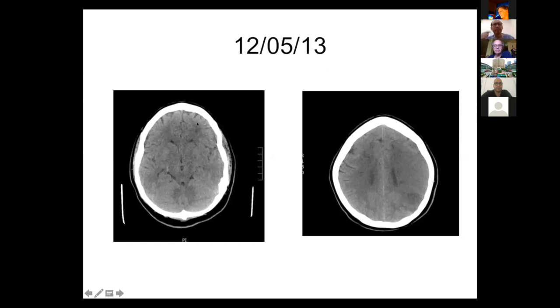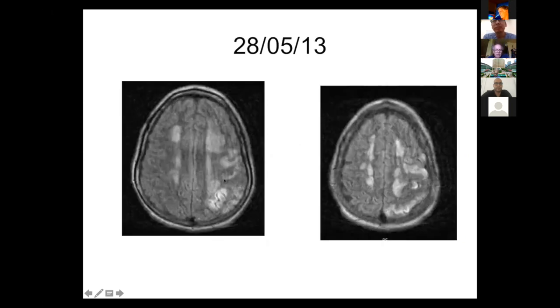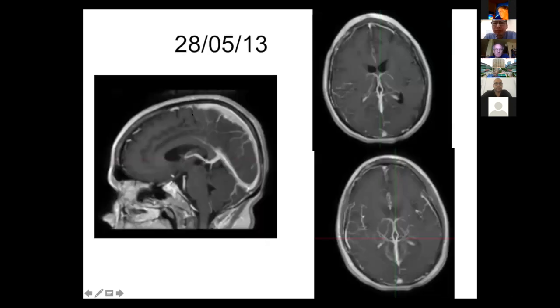The control CT scanner one day later showed all the ischemia and edema in both cerebral hemispheres. On MRI, there were some diffuse changes in the oval center and the old ischemic areas. At reconstruction one week later on MRI, the deep venous system was totally reopened, with no more edema.